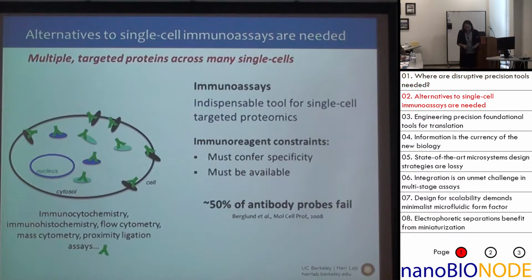The big issue is pathologists, they use a technique called immunohistochemistry. It's basically a stain. So I mentioned ER and PR and HER2 positive cancer, right? They look at the tissue slice. What do they stain the tissue slice with to be able to make that classification? They stain it with an antibody that contains some sort of tag or label, right? So if that antibody binds to the tissue section, you know that HER2 is there, right? Because you're going to see it under optical microscopy. If it binds to ER, you're going to know it's there because you're going to see that signal light up as well.